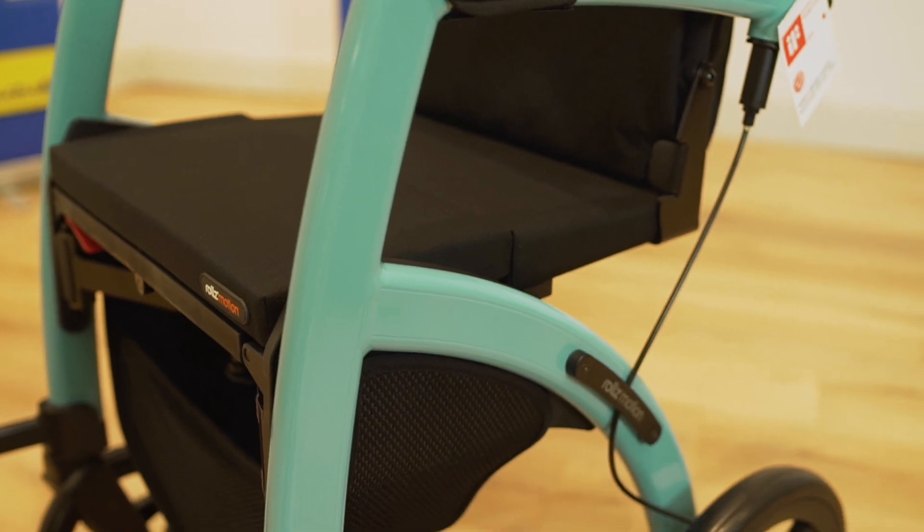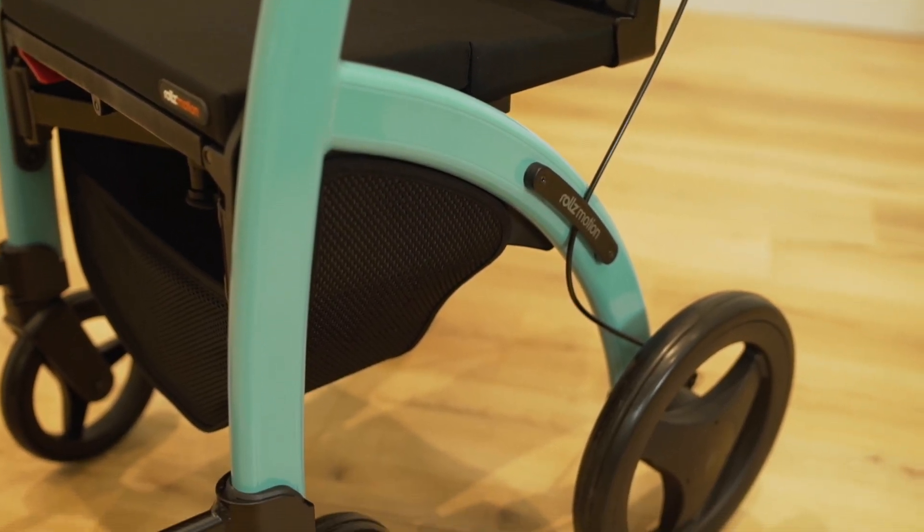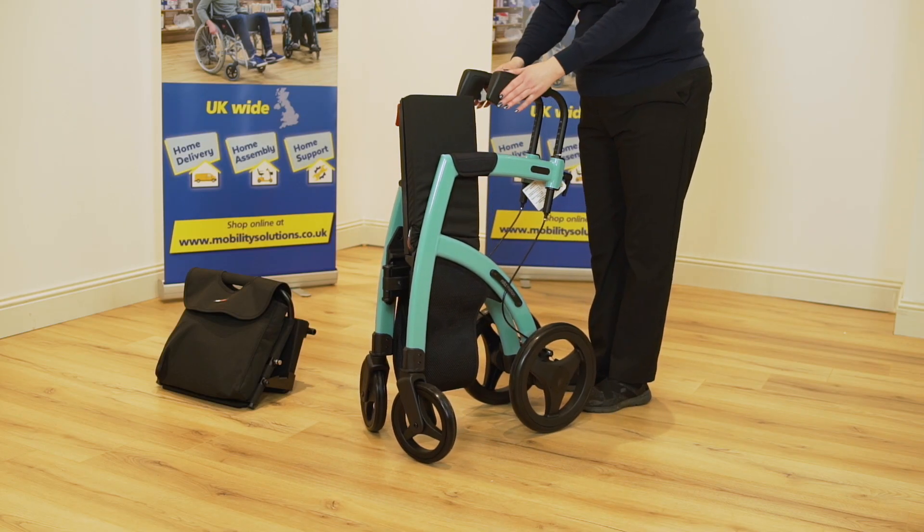With a lightweight yet strong frame, the complete rollator weighs just 10.7 kilograms. The easy folding and locking mechanism ensures it can quickly be stored away when not in use.